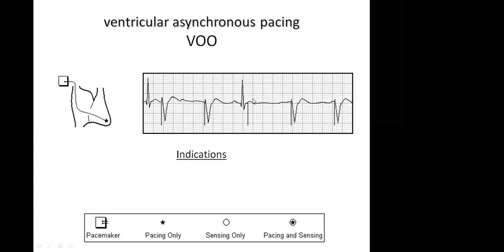So Dr. Duyemi, as you said, it is not sensing the ventricle. As you rightly justified, first thing is first, he's pacing the ventricle, but he's not sensing the ventricle. Why? I'll tell you why. Look at this QRS, the first QRS you said. Look at the short interval between this normal intrinsic activity and the pacing ventricle. Look at how short it is, meaning that he did not consider this QRS at all.